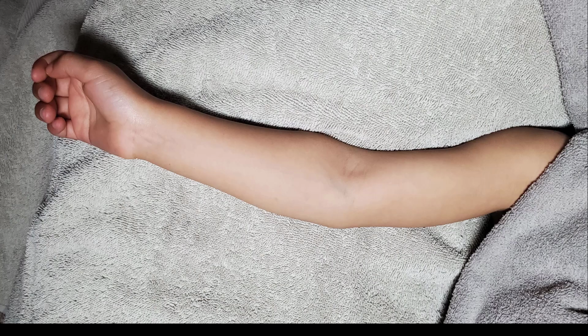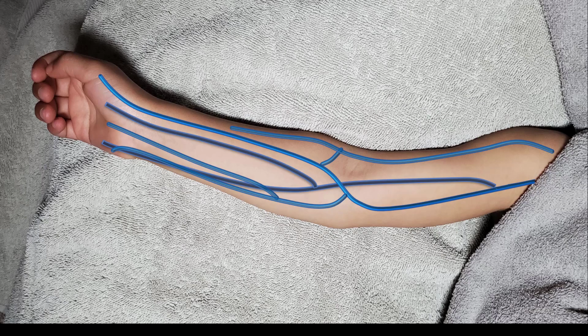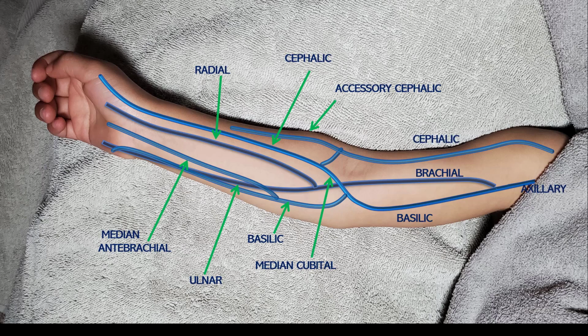As you may have observed, most searches for venous access sites start in the hand and forearm. We recommend that you start in the forearm as depicted here and gradually advance your search up the length of the arm to the brachial and basilic veins as necessary. While distal veins are relatively superficial, they tend to be smaller targets, and you may be asked to look with the ultrasound when distal veins have already been attempted. More proximal sites, while larger, sometimes are closely associated with more sensitive structures and are often slightly deeper, adding a layer of complexity to the cannulation technique.